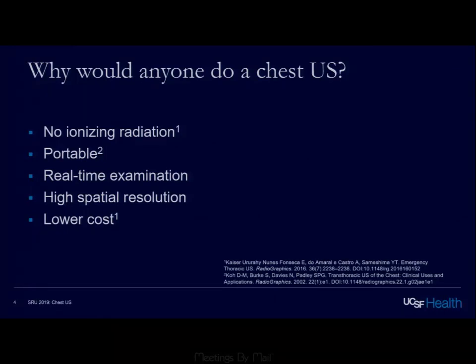In addition to that, some of the additional advantages include the ability to do a real-time or dynamic evaluation, and this is really helpful for musculoskeletal etiologies. Chest wall pathology can actually be quite superficial, so using our high-resolution linear transducers can be really helpful in this setting. And in addition, when compared to CT, it has a relatively lower cost.